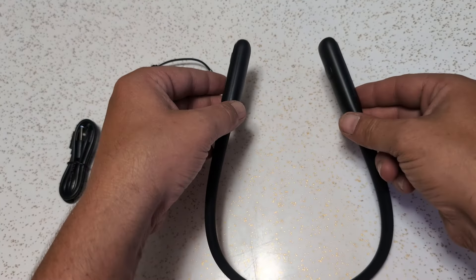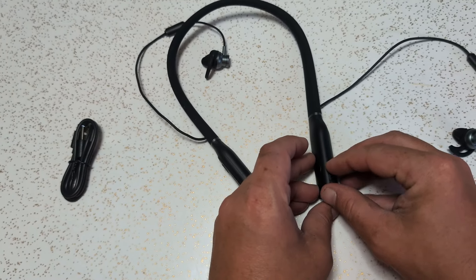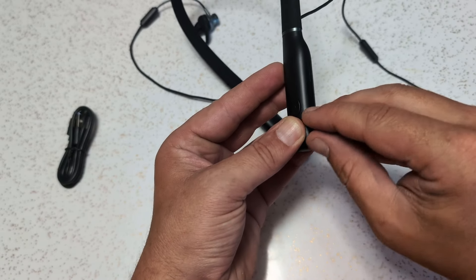Yes, these work, and they work really well. They're actually really, really cool. But before we get any further into this review, I do want to give you one word of warning. When the battery gets low on these, if you have them on and in your ears, it's going to tell you that the battery is low.